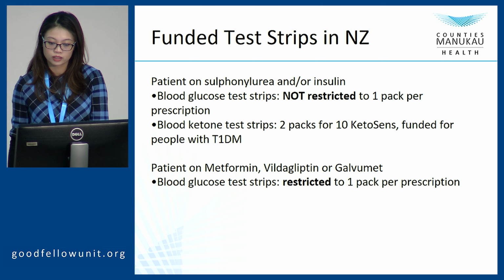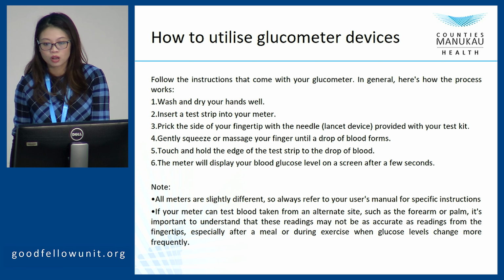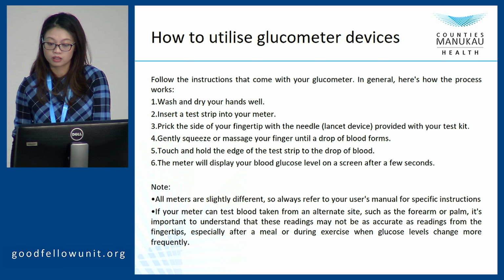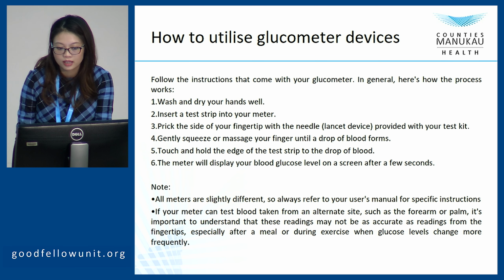So you might ask how to utilize the glucometer. There's always an instruction inside the glucometer. In general, patients need to wash and dry their hands well, and then insert the test strip and prick the side of the fingertip with the needle provided with your test kit.